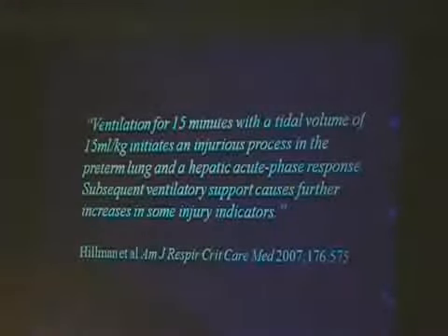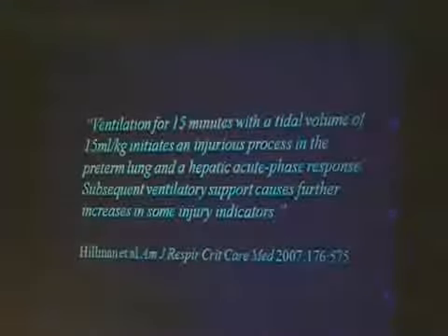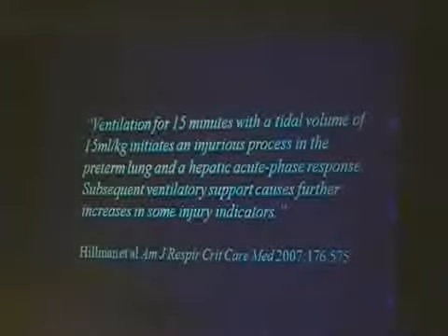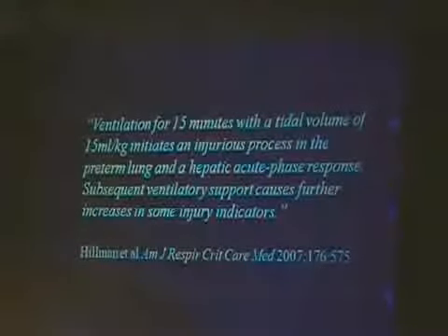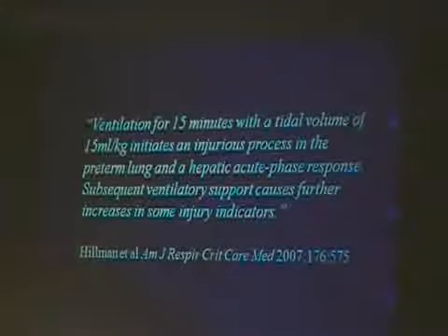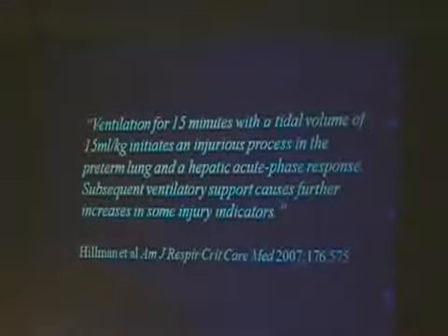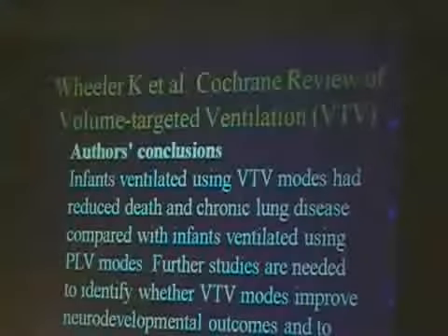And in fact, Alan Jobe has some work that indicates, and he's done a lot of work in neonatal pulmonary, that as few as 6 breaths of tidal volumes of 10 to 15 per kilo causes a BPD-like picture in the preterm lamb model, which has been validated as an extremely close model to the preterm infant.